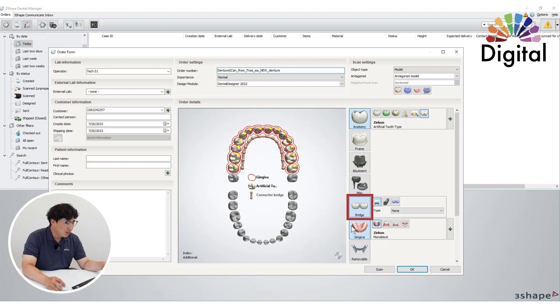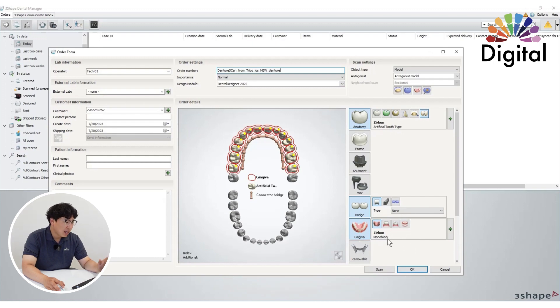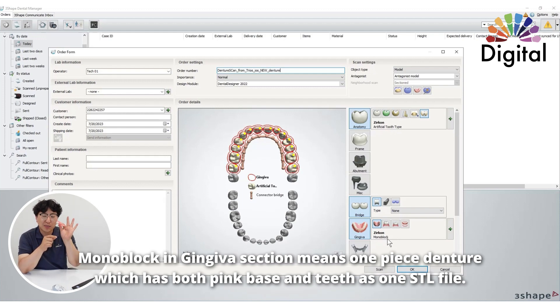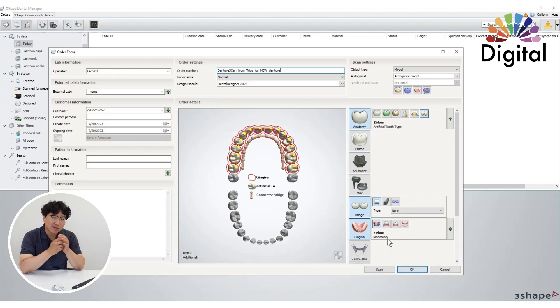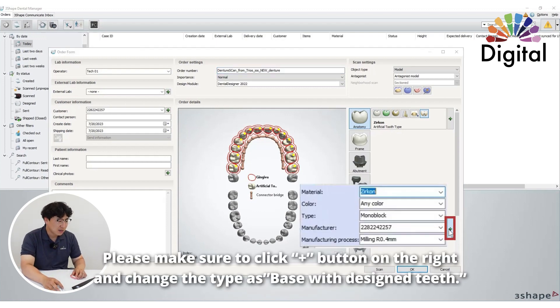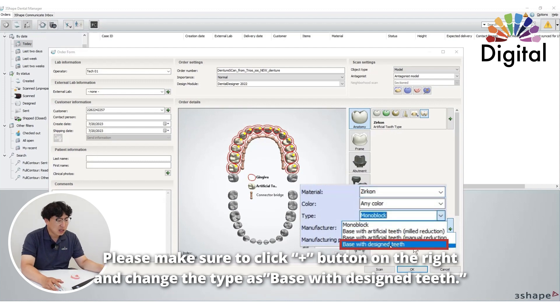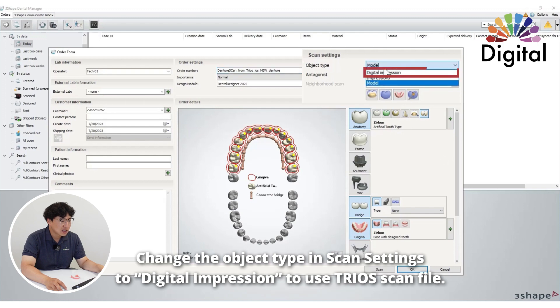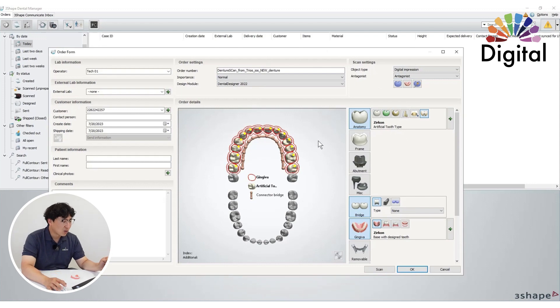One important thing: on the gingiva, it's set as 'monoblock.' Monoblock means we want to make a one-piece denture — meaning the pink base and teeth will come out as one piece, one STL file. But we want two different STLs: teeth and pink base separately. So please go to the plus button and change the type to 'base with designed teeth.' For this case, I have a TRIOS file, so I want to change this to 'digital impression.' Now the work order form is ready.